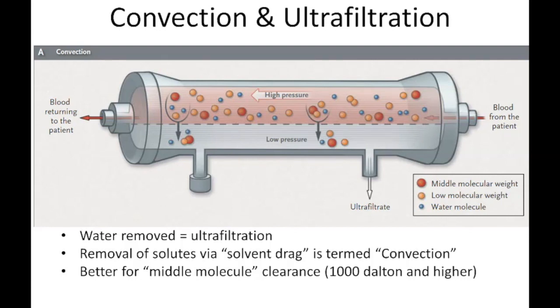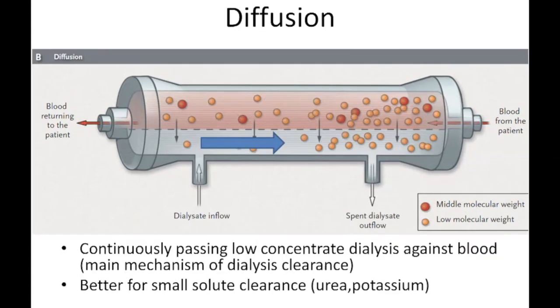But generally speaking, this is just ultrafiltration. And we'll talk about how you can actually use this technique. This isn't very much solute removal. Down here it's some, but you couple this with another technique of fluid replacement, CRRT, and that really leads to a kind of lower concentration of unwanted solutes in a method of CRRT called CVVHF, which we'll get to shortly.